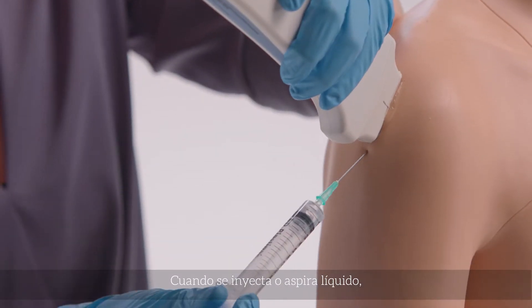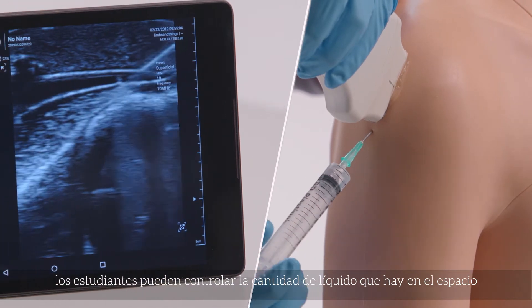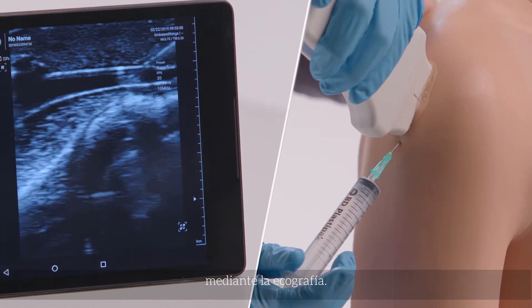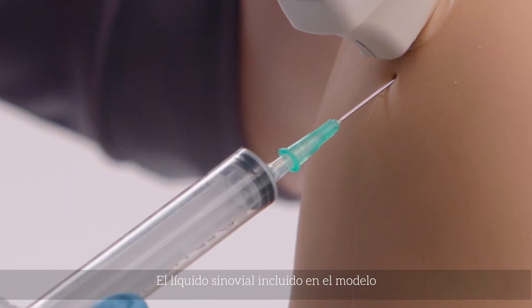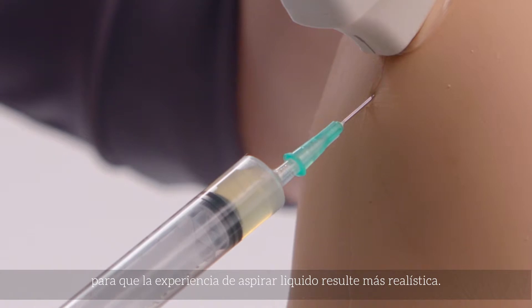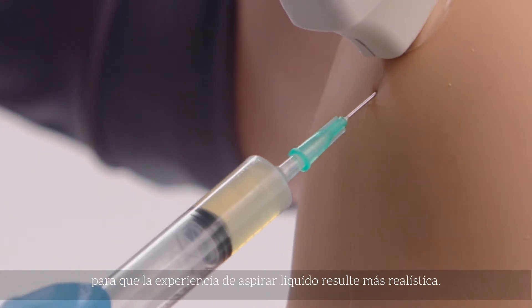As fluid is injected or aspirated, students can monitor the amount of fluid in the space via the ultrasound. The synovial fluid supplied with the model is a realistic color and viscosity to increase realism for trainees when aspirating fluid.